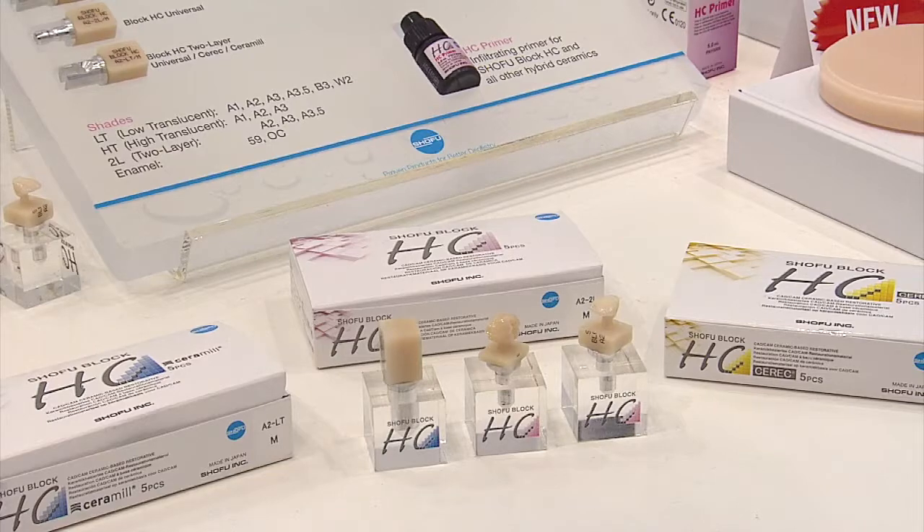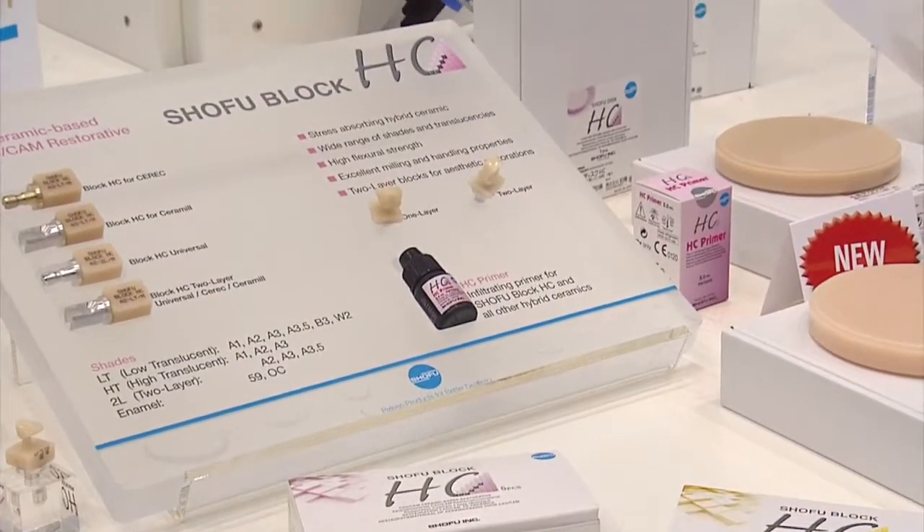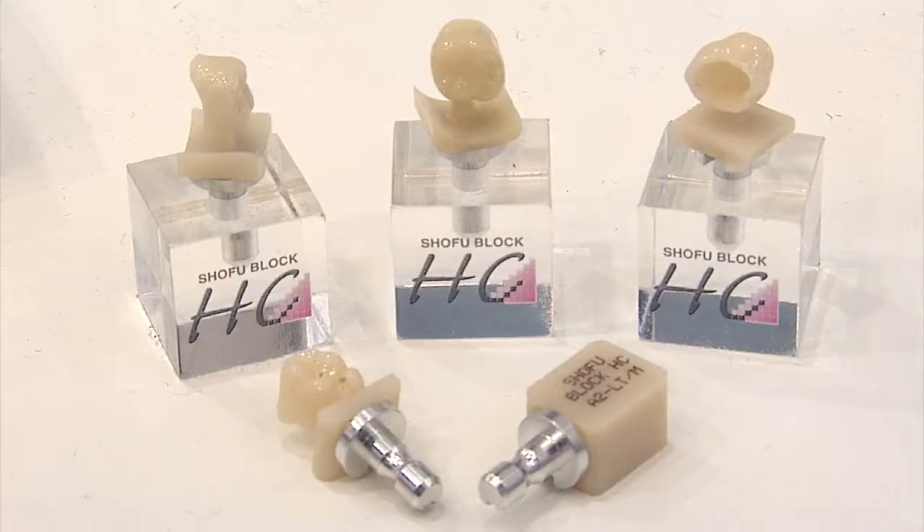The Shofu HC block is a hybrid ceramic material that opens a new dimension to dentistry. It is available for chair-side solutions as well as for laboratory and milling machines.